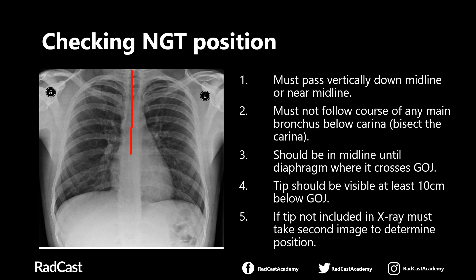Point three is that the nasogastric tube should continue in the midline until it reaches the diaphragm where the gastroesophageal junction is, continuing down the oesophagus to the point where it turns into the stomach. Here, the nasogastric tube will usually deviate to the left, and the tip will be located somewhere in the left upper quadrant within the stomach. You want the tip to be located at least 10 centimetres beyond the gastroesophageal junction at the diaphragm, so that any food and medication given to the patient will be dumped nicely into the stomach and won't be regurgitated back up.